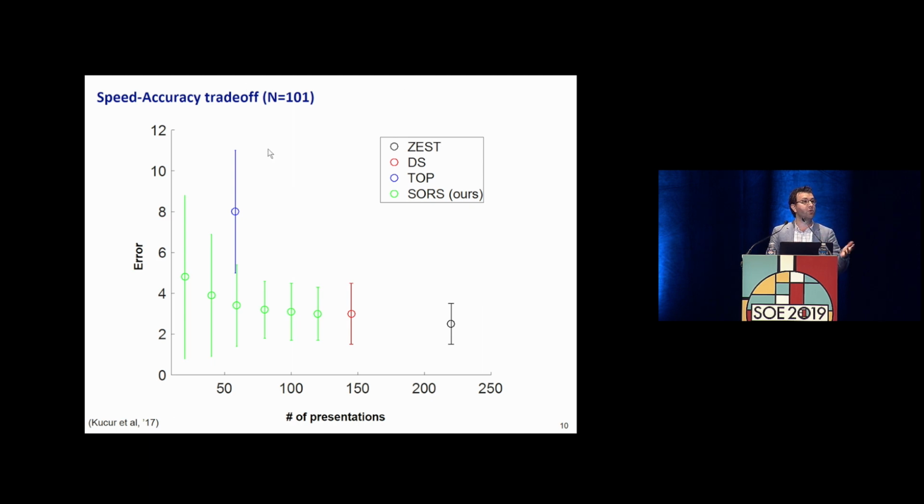You can get visual fields very quickly with low quality or very slowly with high quality. And the method that I show you, which uses AI to fill in the gaps, is this green line. You can stop it whenever you want as a user and see what accuracy you would produce if you were to actually use it. So we see we have a better compromise in terms of speed and accuracy using these kinds of systems.